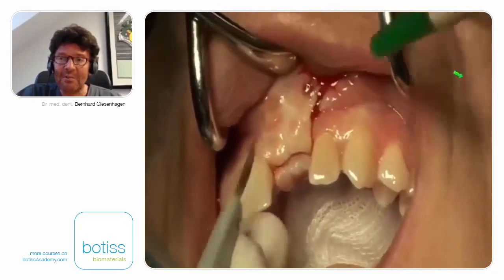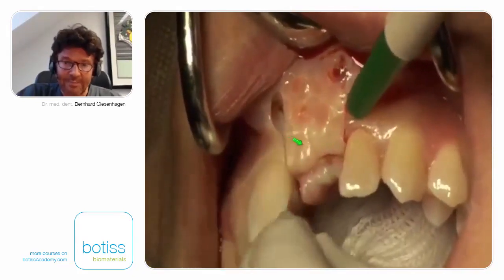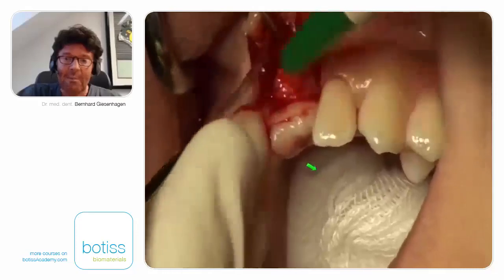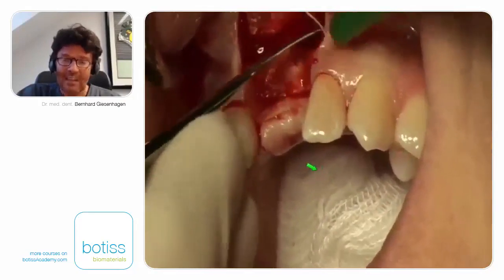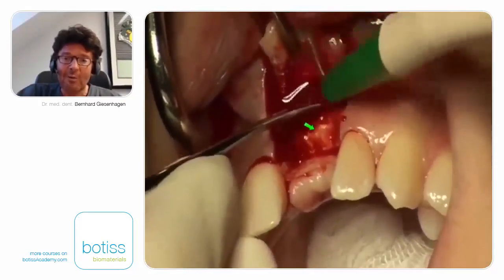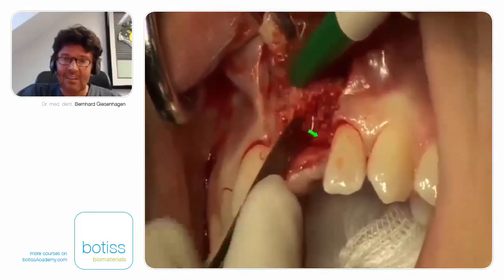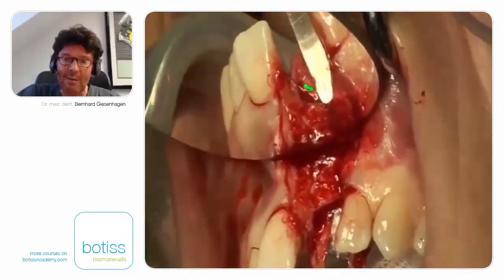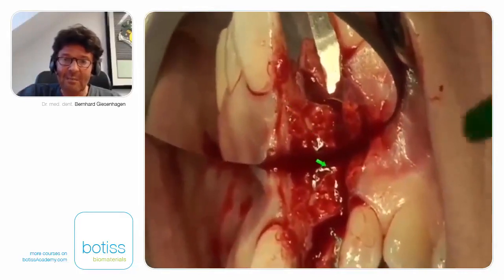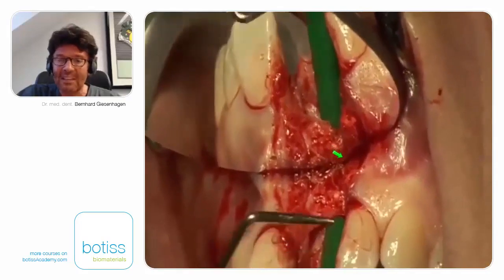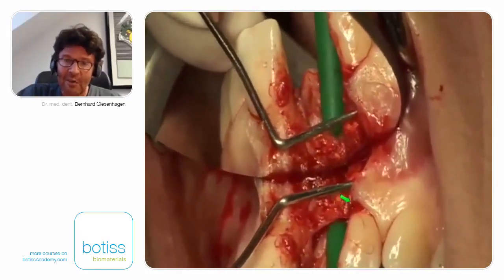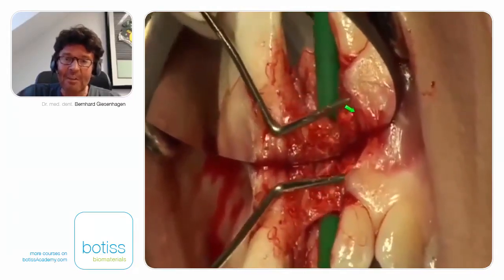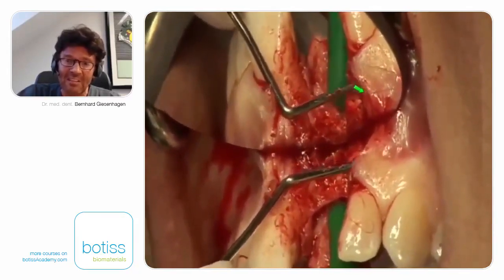We make vertical cuts on both sides and raise the flap to the buccal side — it is always important to see the whole augmentation area in total. It becomes quickly visible that there are only bone graft particles connected by connective tissue, which must be removed. After cleaning the area, a huge defect is revealed with no buccal bone and no palatinal bone. I then measure the vertical dimension from the bone covering the roots of adjacent teeth, which serves as my orientation for the vertical position of the bone ring.